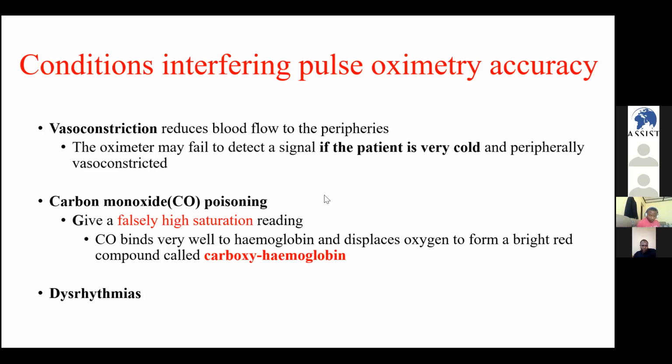So you have to pay attention. In different types of dysrhythmia also, you may get a pulse of poor quality and get false readings of oxygen saturation.